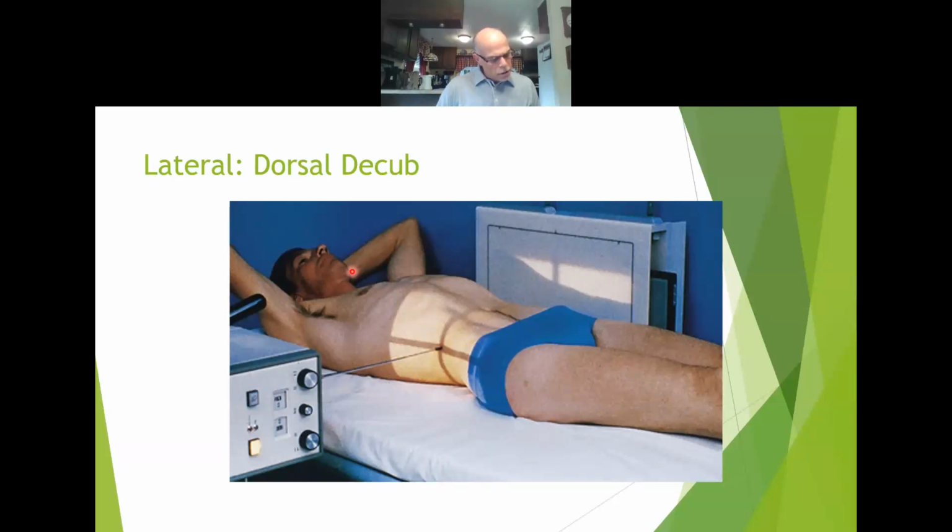Position of the part: position the patient so that the point approximately 2 inches above the iliac crest is centered. So again, here's your soft spot right there. You can see the curve right there. So we're a little above it, 2 inches above it. This is going to be at your mid-coronal line here. This is your horizontal line. It's going to be 2 inches above the curve of the iliac crest. Let's see, it says IR is centered at the mid-coronal plane, so that's the line right here.